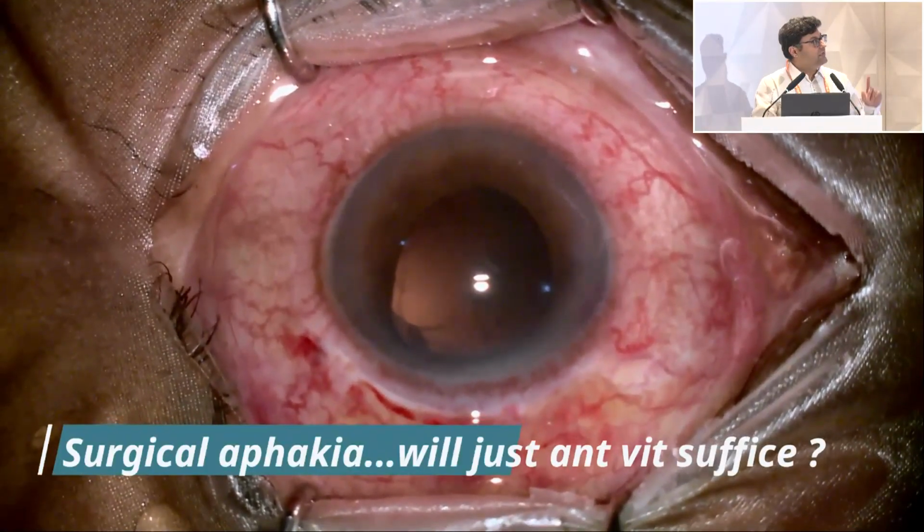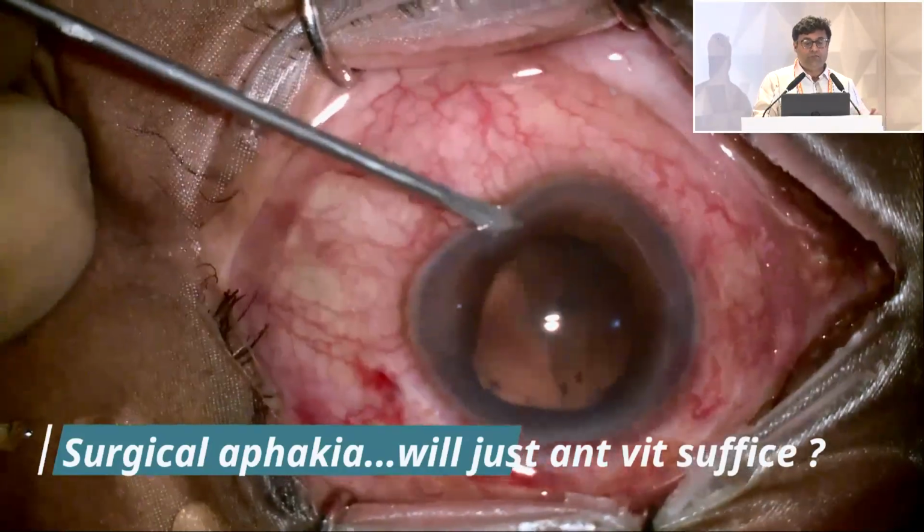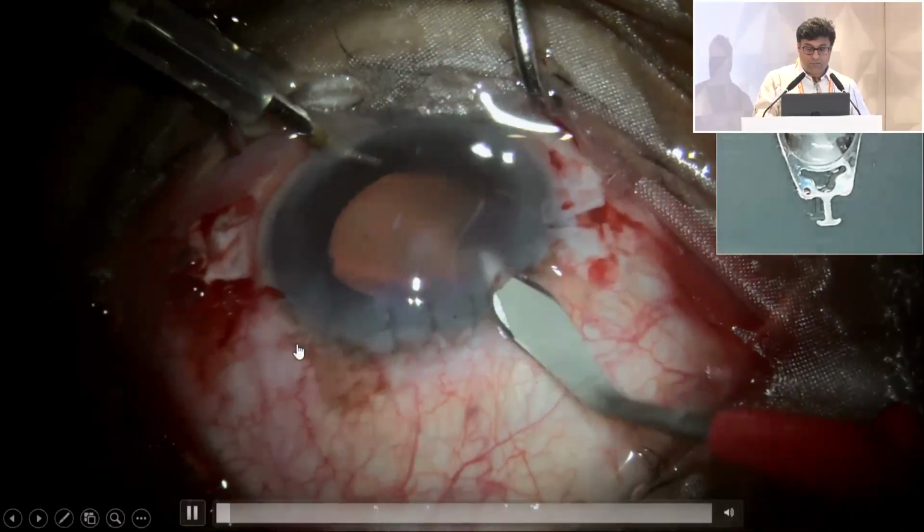Now in this case, again, this is a case of surgical aphakia, and there is some vitreous in the AC, and I was told to put in the lens. And one second.